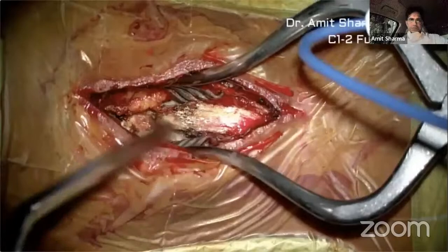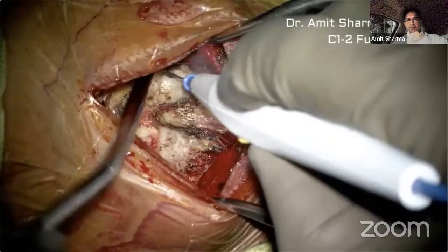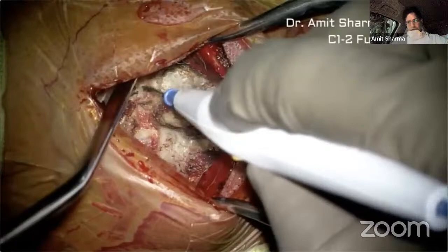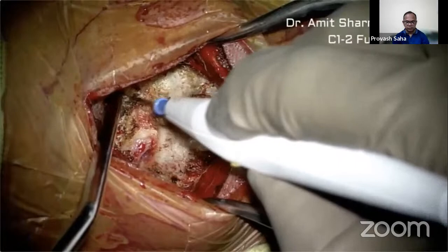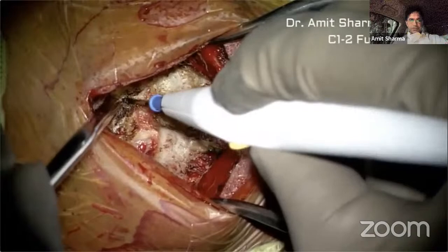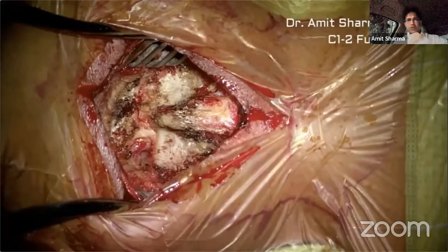Once your exposure is done, the next step is to find out where your C1 lateral mass entry point is. Many of these steps you can do with blunt dissection also, but as I mentioned, I prefer to do a sharp dissection to prevent any bleeding during dissection. So the only bleeding we'll be encountering will be at the time of exposure of the C1 lateral mass. You have to study your bony and vascular anatomy in detail beforehand so you don't inadvertently injure any of the vascular structures.